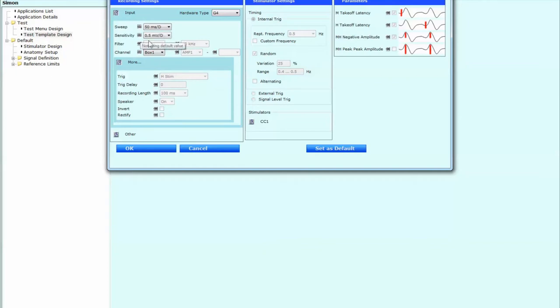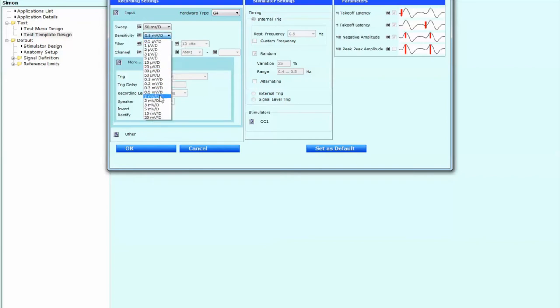Let's keep the sensitivity as it is 0.5 millivolts per division. If we wanted, we could slide up to us. We can do we could make it maybe one if we want. Doesn't really matter.